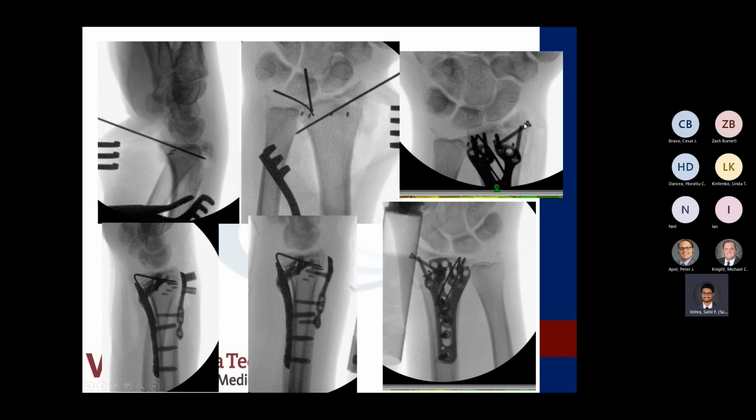And then after we did all that volarly, we went dorsally and put our dorsal plates along with another row of anchors to help attach back the dorsal capsule. And this was our final construct. And then we ended up putting an X-fix on just to maintain him, because we were worried about that sort of carpal shift. We wanted to just let the capsule heal in before we really had any strain on it.